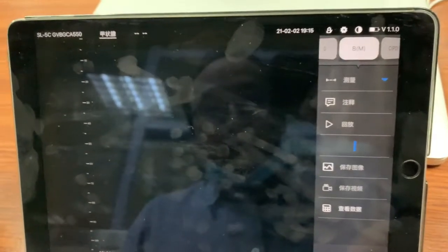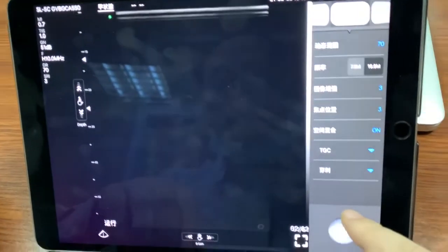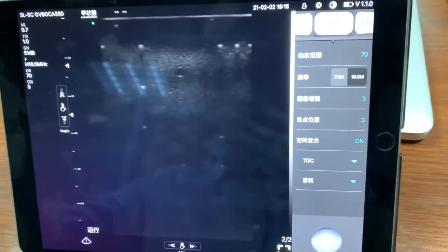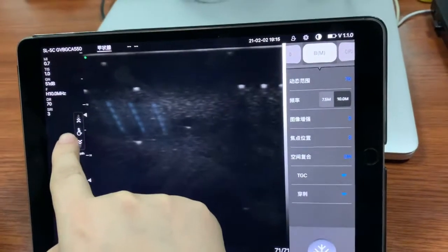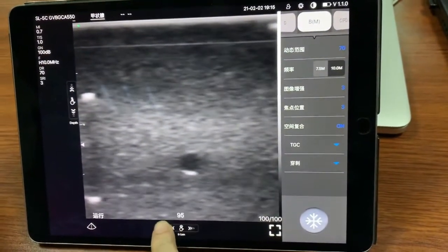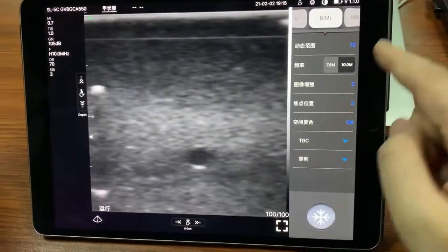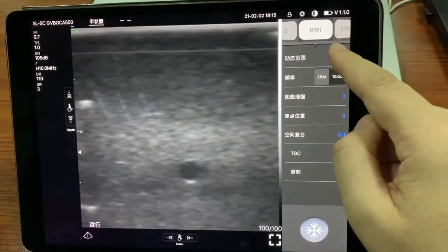Here is the freeze button to freeze the image. We can also turn around the image, adjust the depth of the image, and adjust the gain of the image. And we can switch and adjust the dynamic range of the image.